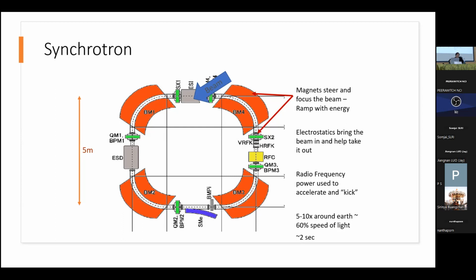And second, these dipoles, you have to really start making them so that they can also act as a quadrupole. What that means is, as the beams are going through, as they're bending, you can kind of think of it as a mirror. As it's bending on the dipole, it wants to spread the beam out. And if the beam spreads out, the less you can actually focus it eventually to the patient. So you usually use quadrupoles then to refocus that beam.